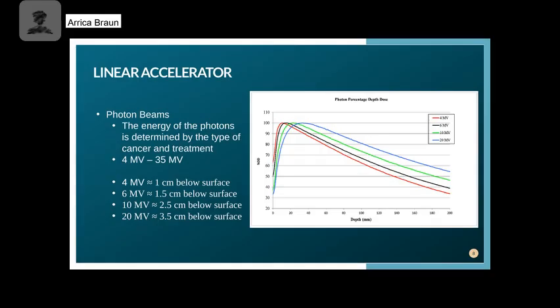So just like with X-ray, where we might have different kVps set for different protocols, let's say for a chest, we might be doing 120 kVp versus a hand could be 55 or 60 kVp. The same thing is kind of true within radiation therapy in the sense that we have different energies that we utilize, but we don't pick these as therapists.